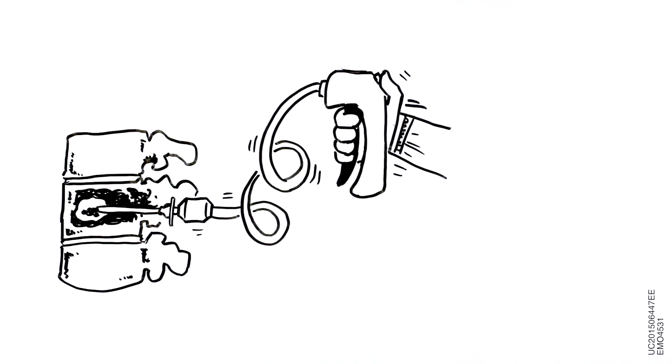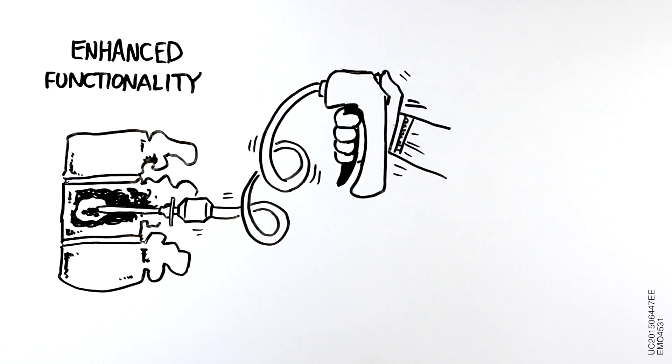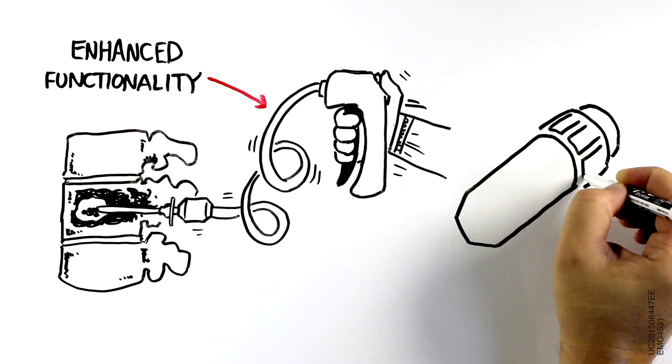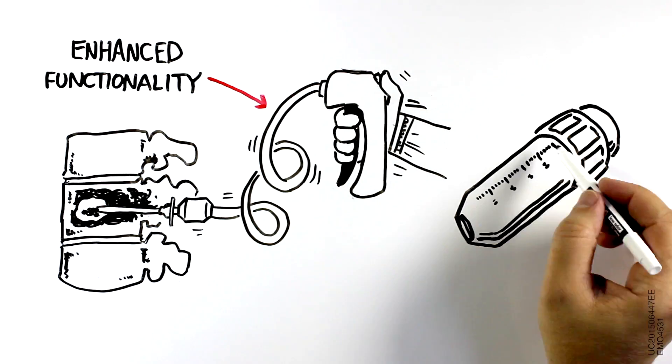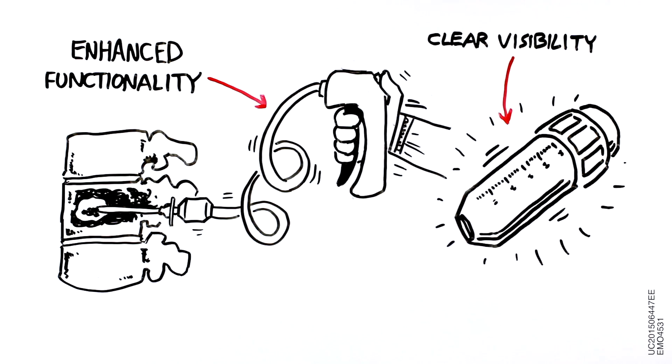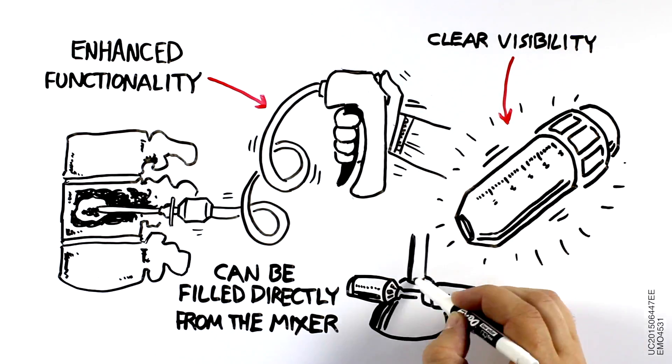The CDS system has recently undergone some serious improvements. Enhanced functionality of the gun is now combined with transparent cement cartridges with high contrast markings for clear visibility of the quantity of cement being deployed, both of which can be filled simultaneously directly from the mixer.